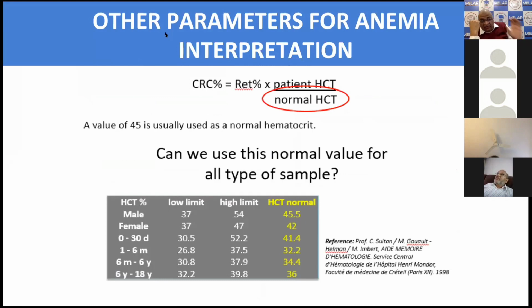Why are we discussing this reticulocyte count in detail? Because these things are not given exactly in a detailed, simple manner in most of our textbooks; we have to accumulate them from different books. What we generally follow is the reticulocyte count percentage: if we are counting 100 RBCs, how many of these reticulocytes are showing in a preparation? But it has some limitation.